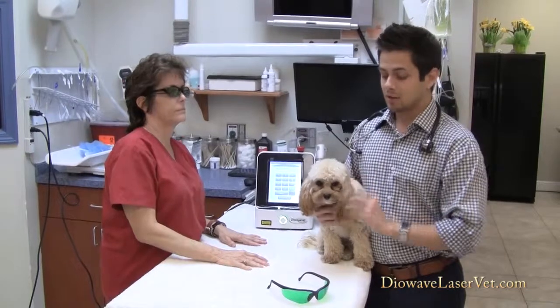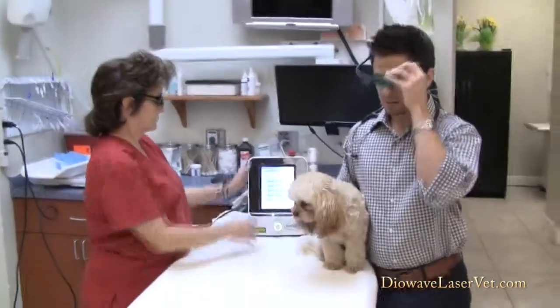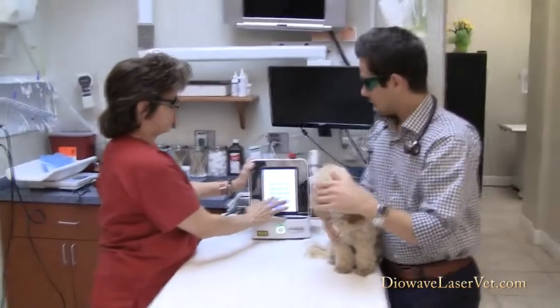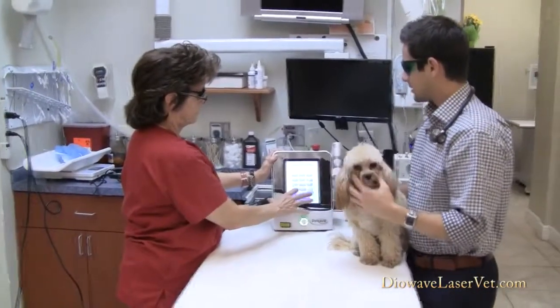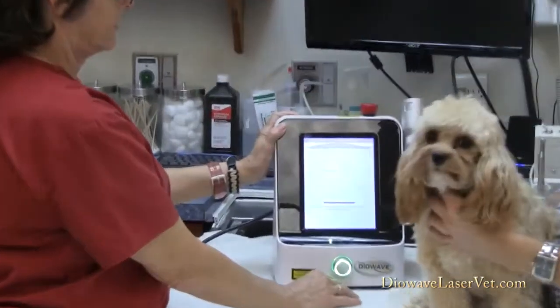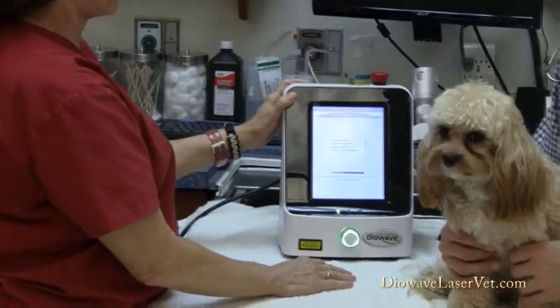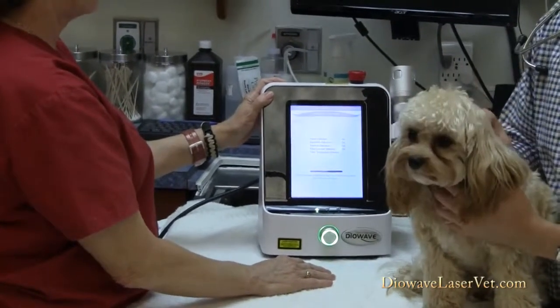All right, so we're going to go ahead and put on our glasses to make sure that we're all protected. And Cindy's going to punch in the code for the laser device, and we're going to get everything all set up. It detects to make sure everything's working properly, so it takes a few seconds.